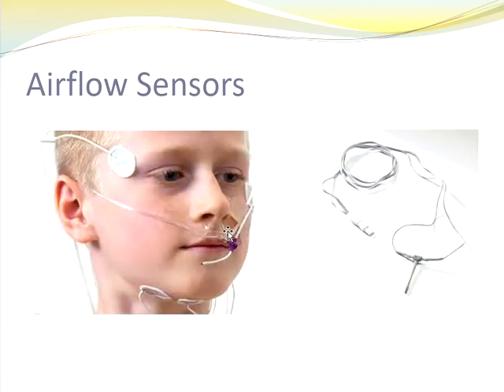They either have to take this off completely, or I tell them to lift it up, set it on the bridge of your nose, get it out of the way. But again, luckily that's something that we're coming across fewer and fewer.